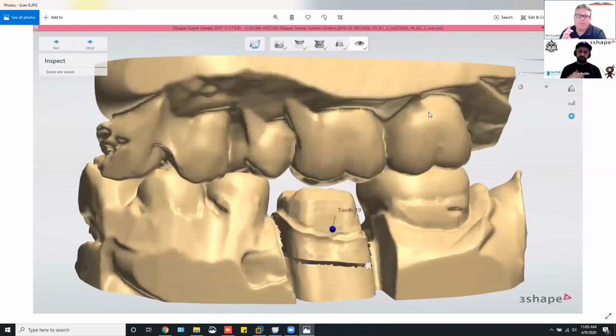So you have like 3 or 4 working plates with the blue tack on, right? Yeah. With the 3Shape scanners, ever since the very beginning, they've sent you 3 plates and blue tack. I put a little bit of blue tack on one, the same amount on the other, and then a little bit more on the third one, and I make it into like a mountain.